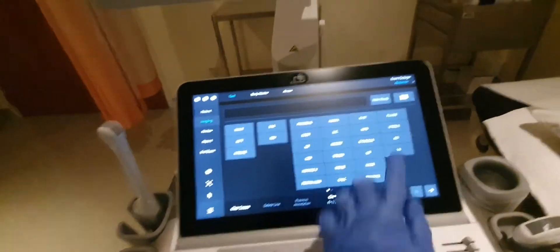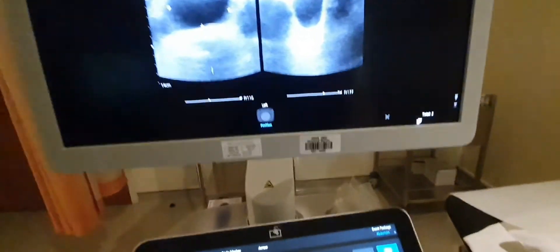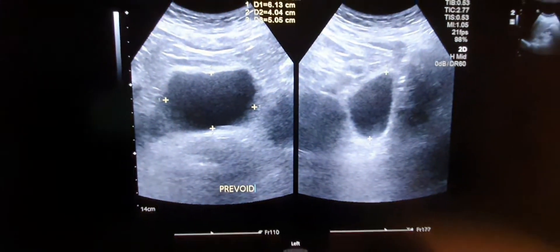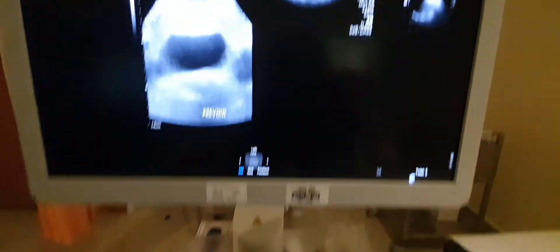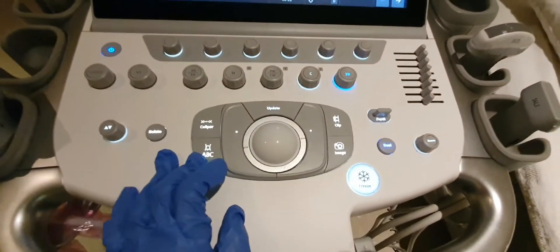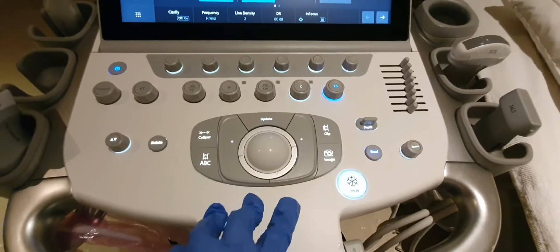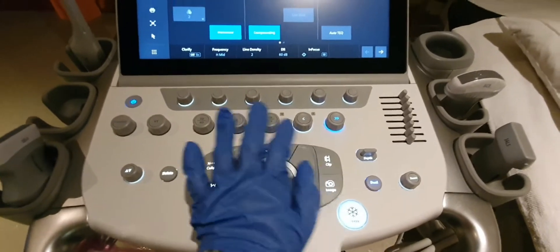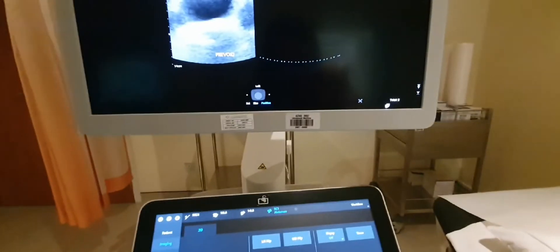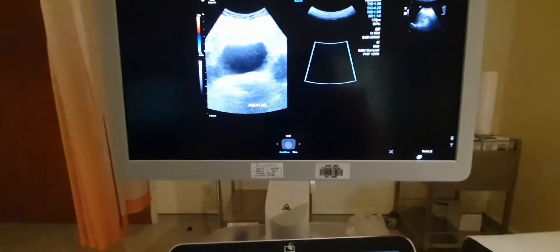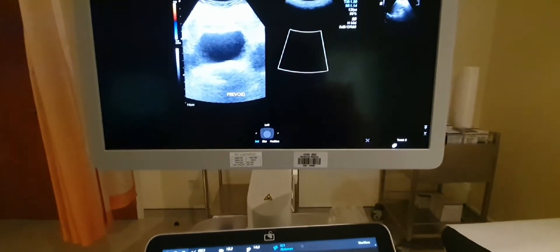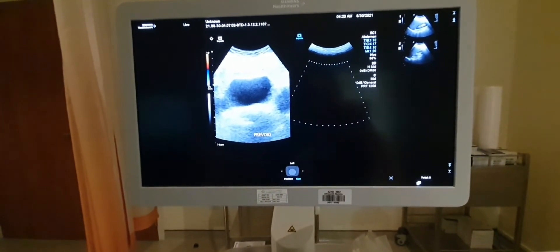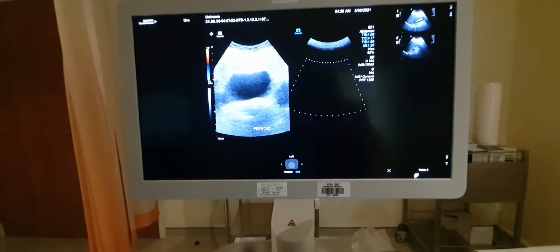Then add the annotation — type 'pre-void' or 'post-void' as appropriate. You can also adjust the color Doppler box using the trackball to position it where you need it. There is also a physical keyboard for manual typing.